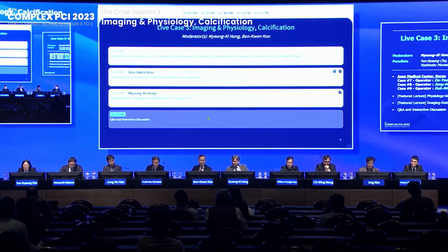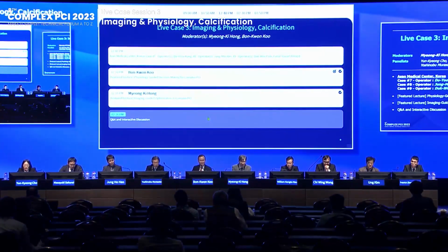I have a question for Dr. Koo. Thank you for your nice presentation. Now we have several modalities to evaluate coronary physiology.